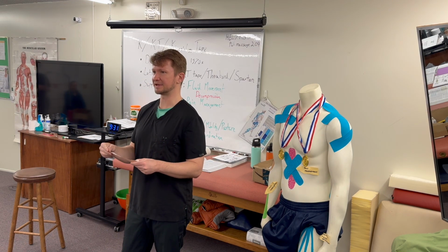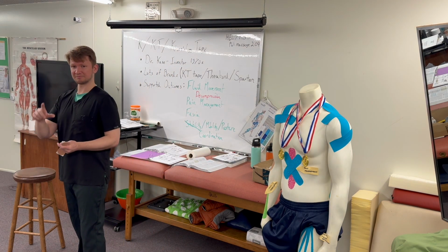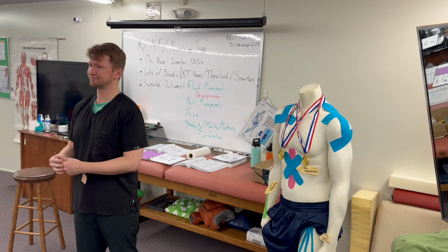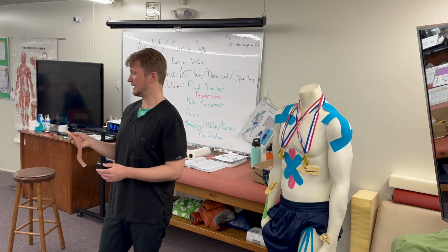There are plenty of people who get the big rolls and then pre-cut a bunch preemptively for their needs. They make a bunch of small ones, a bunch of medium-sized ones, a bunch of big ones. But it's like anything: this costs less, more labor. This costs more, less labor. There you go.